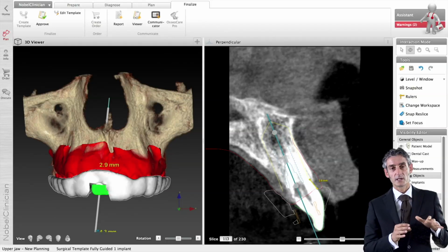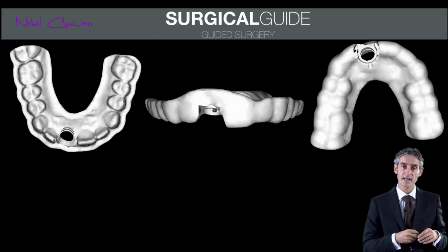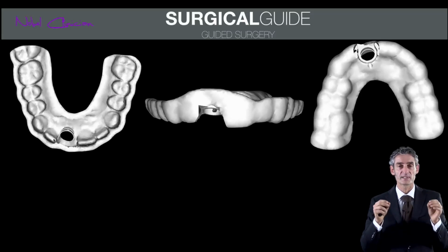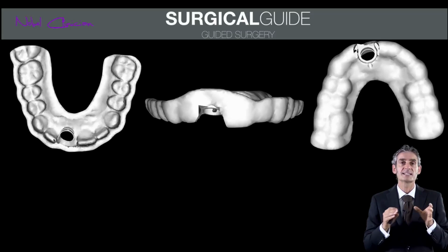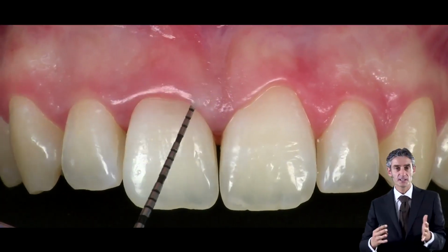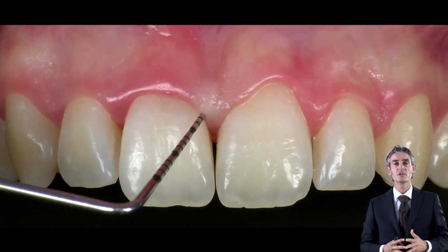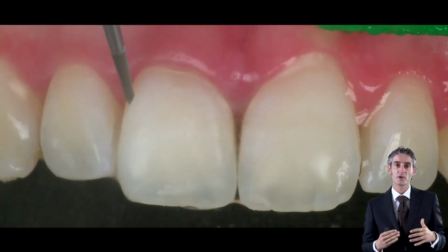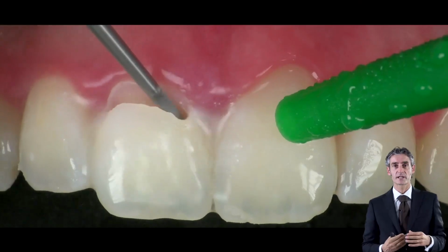If we are in a condition like this, where we can use an intraoral scanner and take an impression, for sure the surgical guide will sit more precisely compared to what we can obtain using only the CT of the patient. Here, for example, you see the clinical approach. Right now I have my tooth, and I have to remove it, but to remove the tooth while leaving the buccal shield, what we normally have to do is cut the crown of the tooth horizontally.